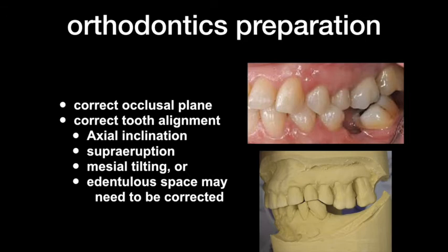And remember, when a patient loses a tooth and doesn't restore it right away, you might cause some teeth to have mesial tilt or migration. If that tooth is not in the proper location, it might affect your design of the path of placement, or you might not be able to use it as an abutment. If that really happens, then you will need to ask the patient to do orthodontic treatment if you still want to save the tooth and use it.